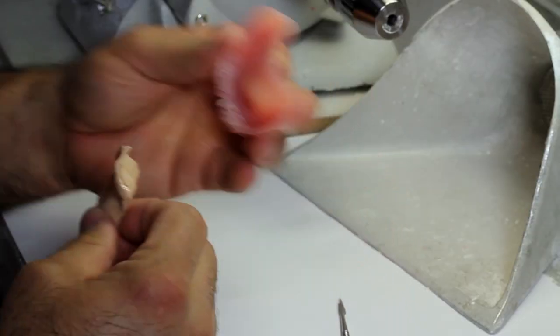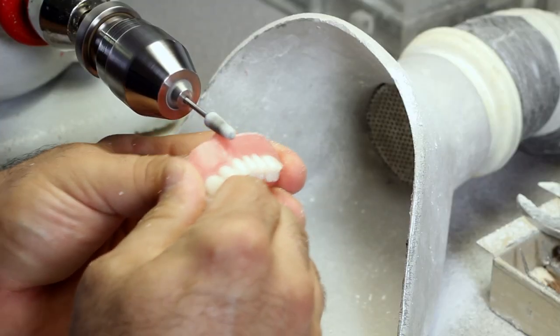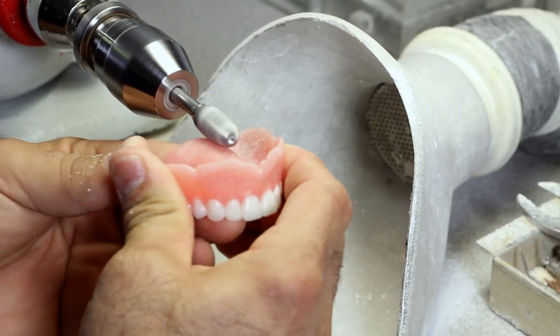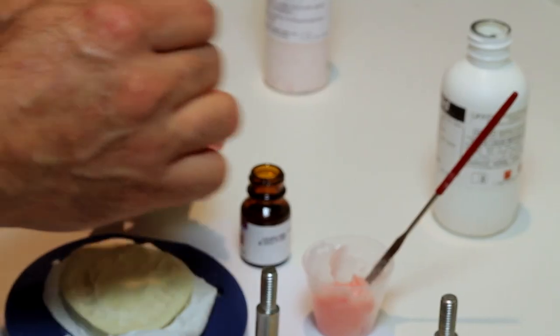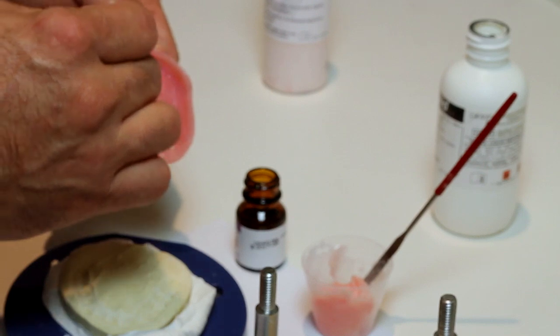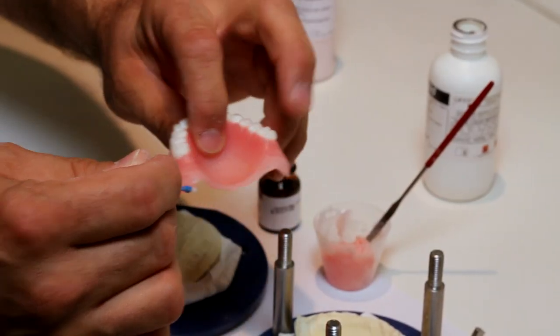Grind out the impression material and some of the existing denture base material for better adhesion of the fresh material to the working denture. Clean the denture and coat the prepared surface of the denture with Lange's acrylic primer.